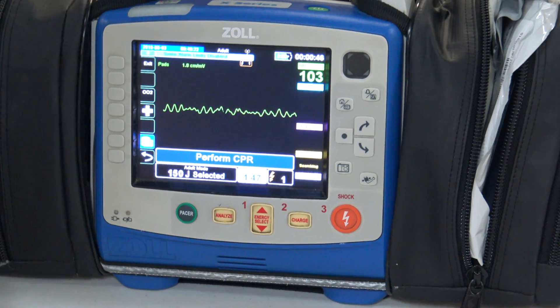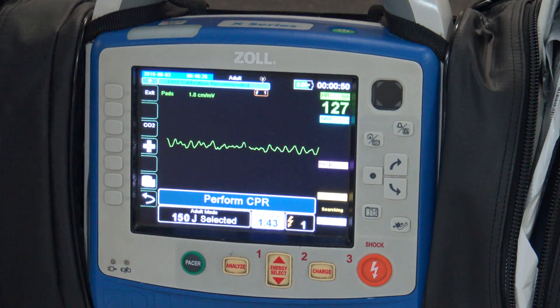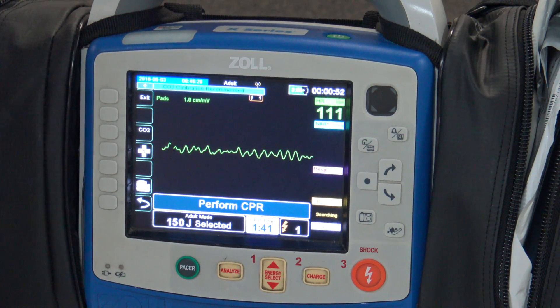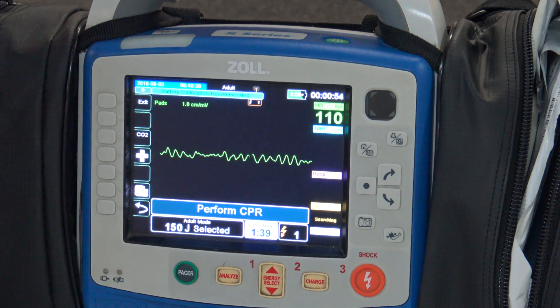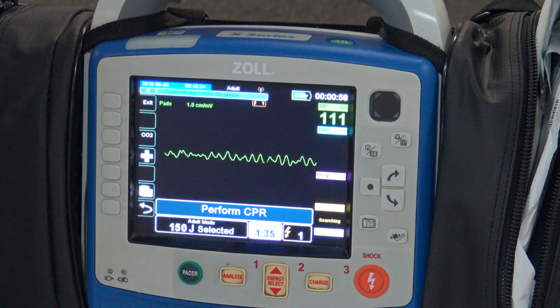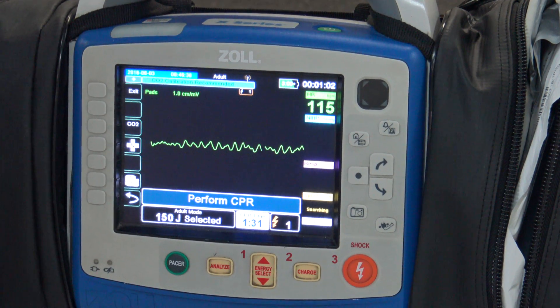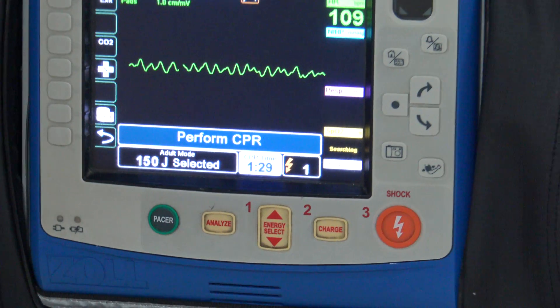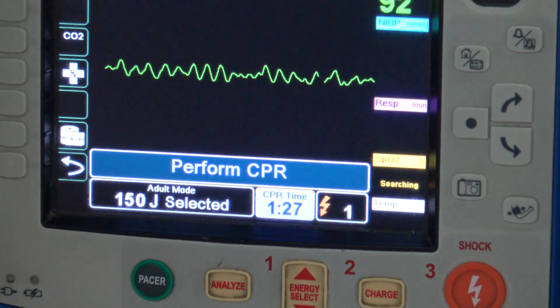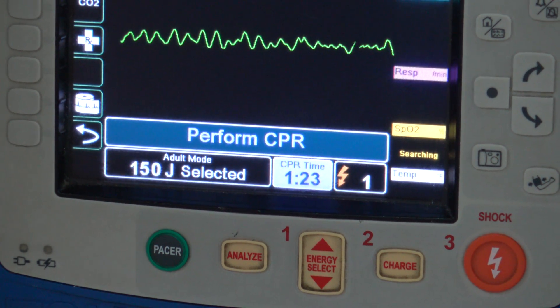The benefit of doing this is it takes a couple of pieces of guesswork out of it. Number one is determining whether something is actually shockable or not, which for us paramedics probably won't be a problem, but this can be utilized by EMTs as well. The other thing it does for us is keep a CPR timer — you'll see down here a small clock that's counting down, and this is what's going to direct how the code runs.